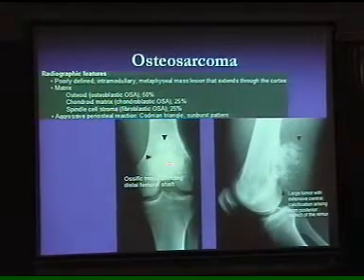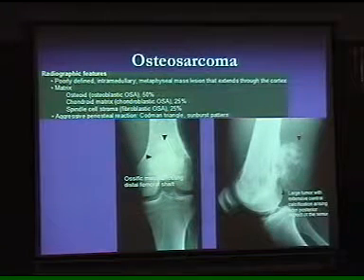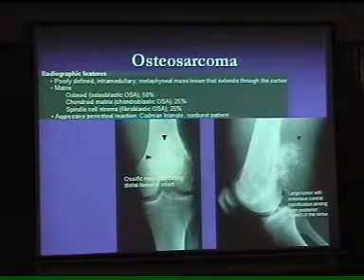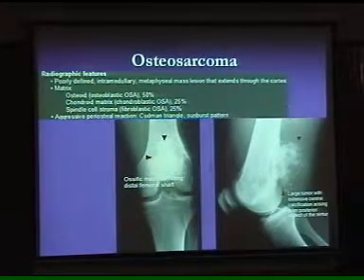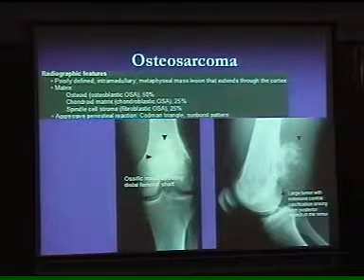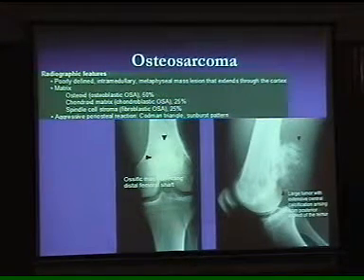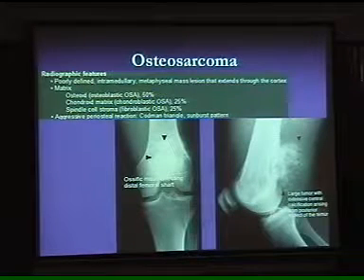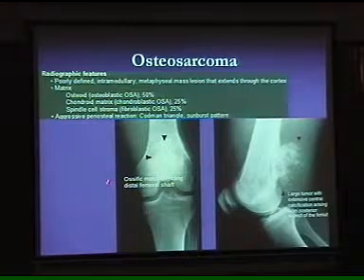Second, osteosarcoma, you can appreciate, that is the AP view. Always, please, in bone X-rays, get 2 X-rays, because in one view only, the AP view, you may miss the pathology. All the X-rays of the body are AP view except chest, and that is PA view. You can ask for a skull X-ray, AP view, any X-ray, but only chest is PA view, because in the chest X-ray our interest is to look at the lungs, and the heart being more close to the cassette, we call it the PA view, not the AP view.